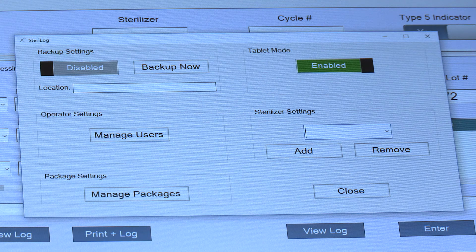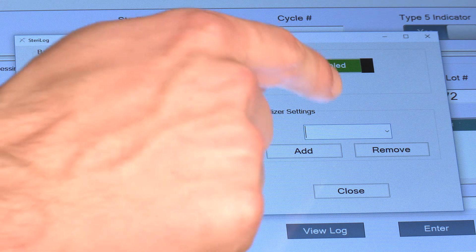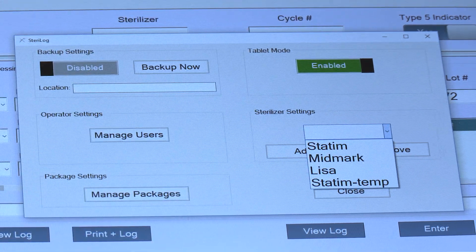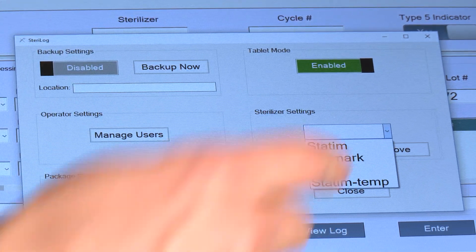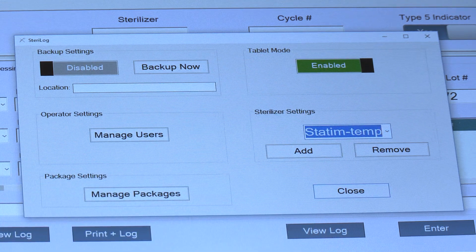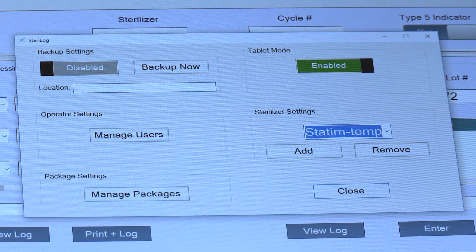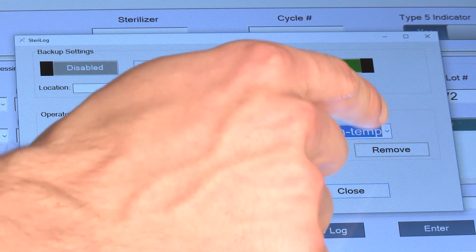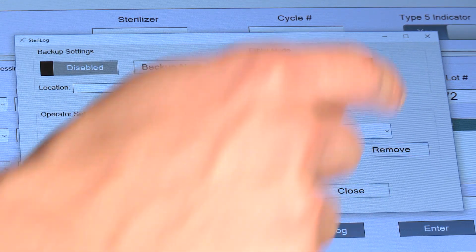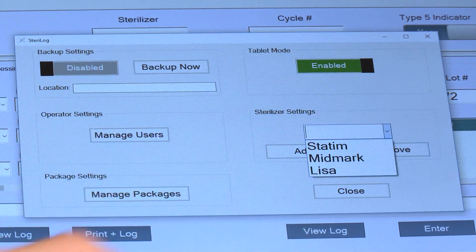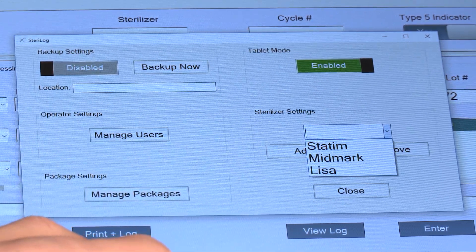To remove a sterilizer, simply hit the dropdown here to view all your sterilizers, select the one which you'd like to remove, so in this case Statim-temp as an example, and hit Remove. Now the sterilizer has been removed from your settings.